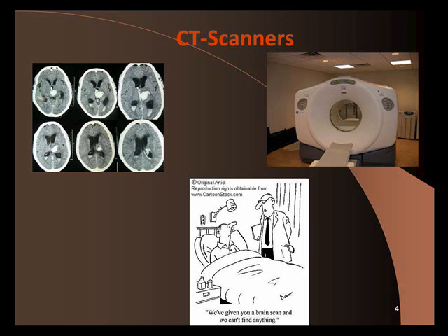These here? When it comes to the monitor, is it a picture or does the patient move? You mean this monitor right here? Yeah. This is for fluoro. This is for fluoroscopy. So when the patient moves, it moves on the monitor as well. You can see patient breathing and movement. I mean, the purpose is not to see the movement really.